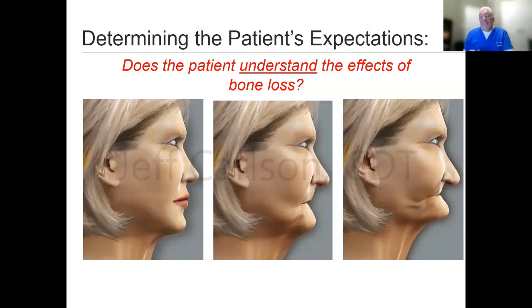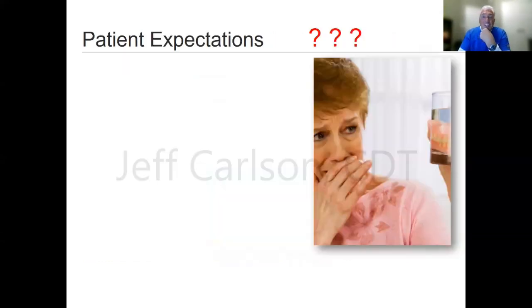Maybe some of you never heard this phrase. Dental implants have a nickname. They're called bone maintainers. If you had an extraction socket and you put an implant in and didn't do anything else, typically the body doesn't recognize the implant as a foreign object, and it's going to grow around that. So even if you never loaded it, it helped to maintain that bone, as opposed to having a deficiency, as you see with Pontics and Crown and Bridge Pontics that we've done for many years.